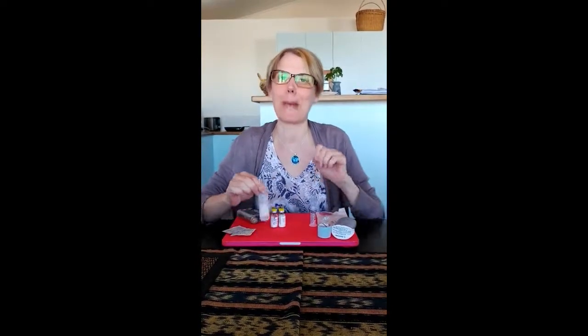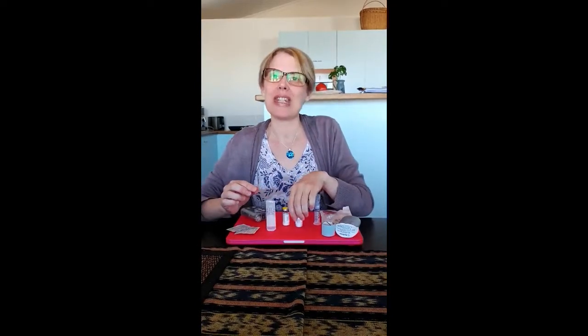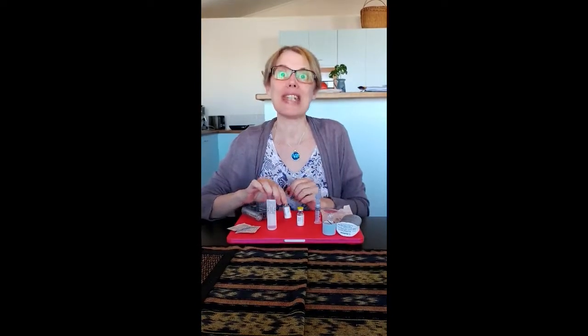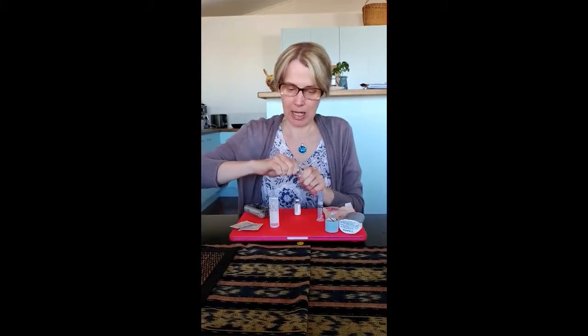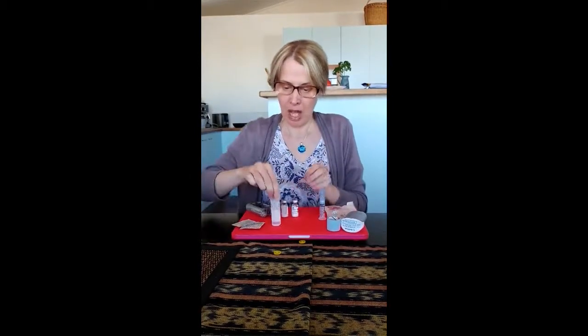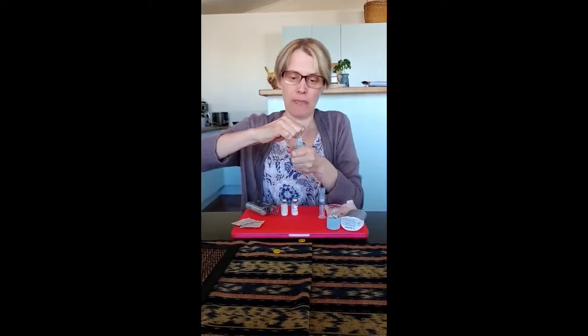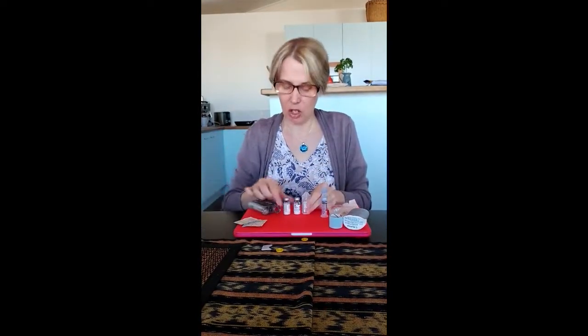The first thing I do — and I have a little trick that I learned from another member — means that I don't need to use needles at all. I take the tops off my Solu-Cortef and they are sterile so I don't wipe them, and I take the top off my sterile water, so I'm using a sterile water and Solu-Cortef combination.